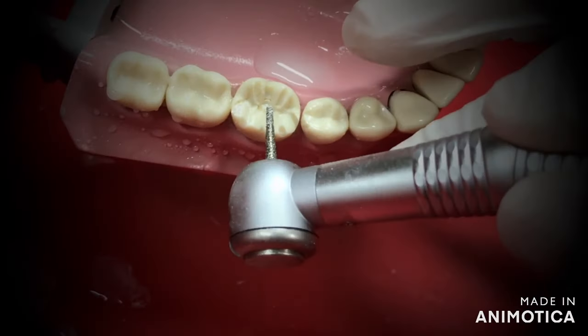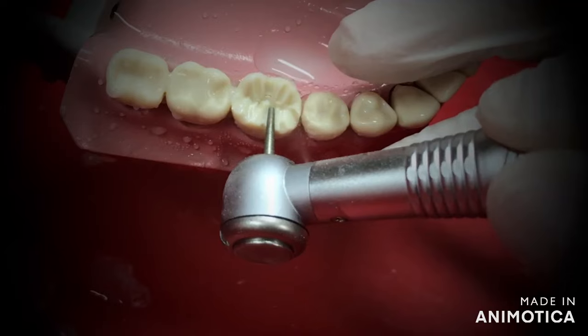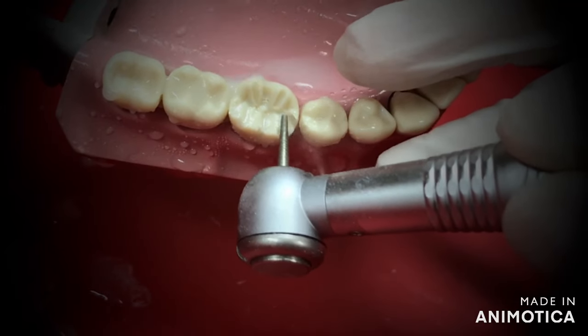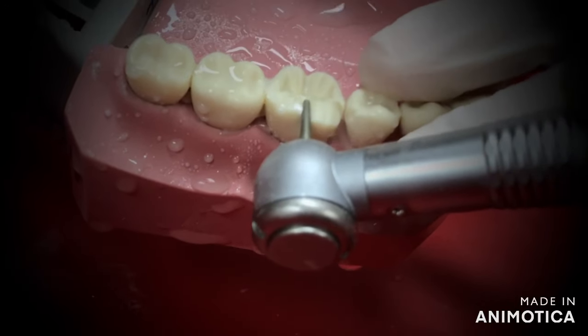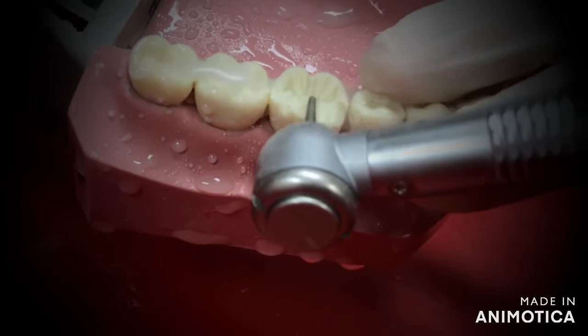Start first with the buccal part. Make sure you follow the original tooth inclines at all times, as shown in the video. This enhances the retention and the resistance form, preventing any dislodgement of the crown.